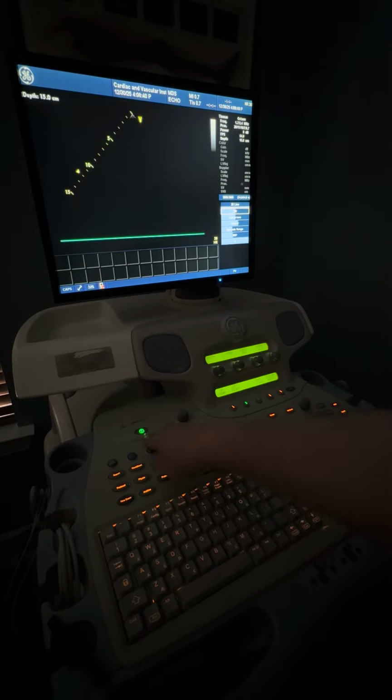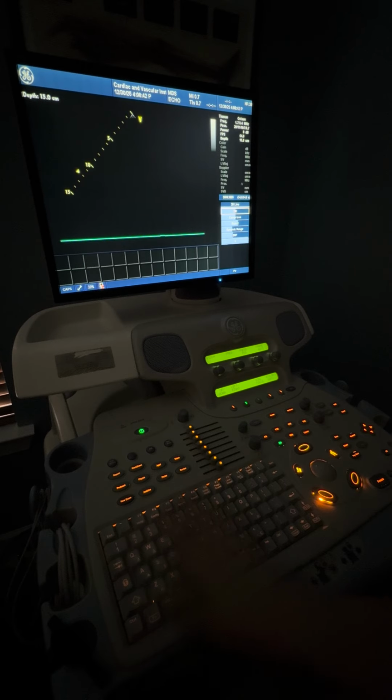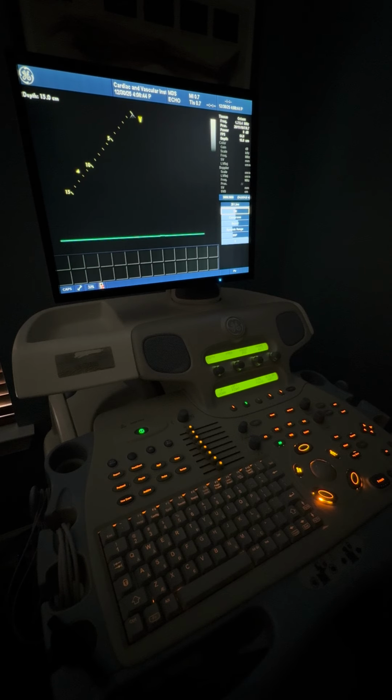Of course, down here, you can see that we have a tactile keyboard right here on the console as well, so that you can begin to annotate directly by typing on the screen. It will pop up and you can move that over.